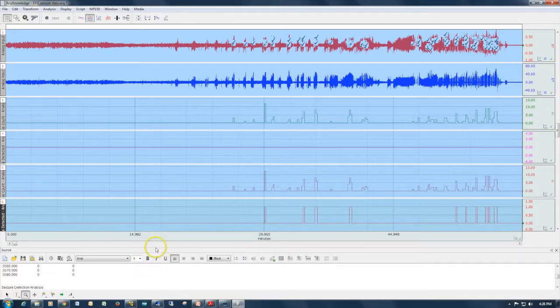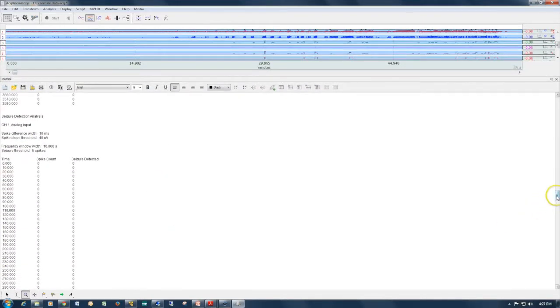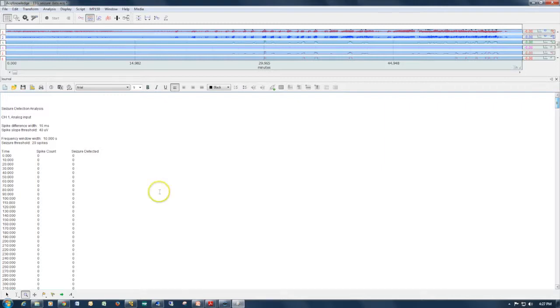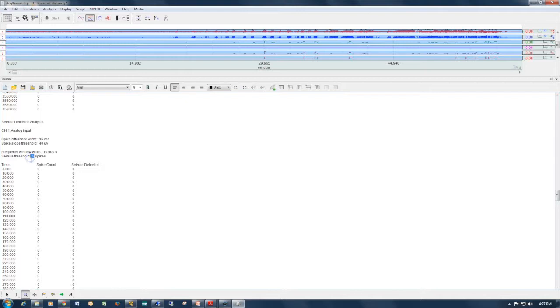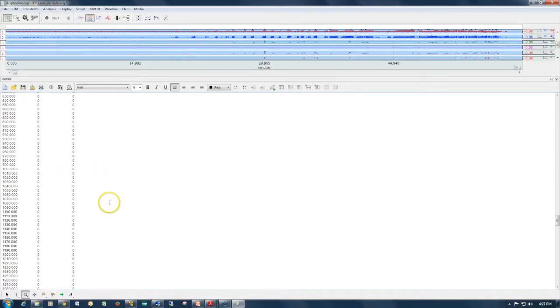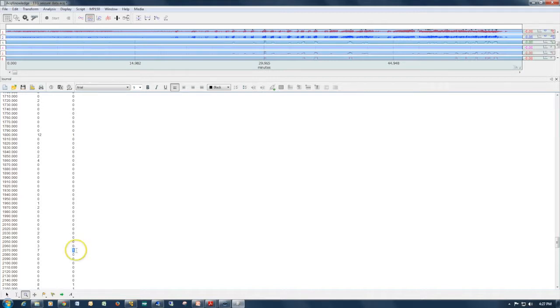In the spreadsheet output, the first run looked for 20 spikes within a 10-second period, and the second run reduced the required number of spikes. The software reports results for each epoch — here's the first 10 seconds, and all the way through with no spikes counted, therefore no seizure identified. Scrolling down, seven spikes were counted in one epoch, so a one is placed in the seizure identification column. That gives you a quick run through.